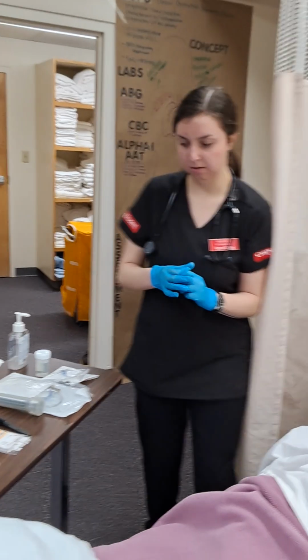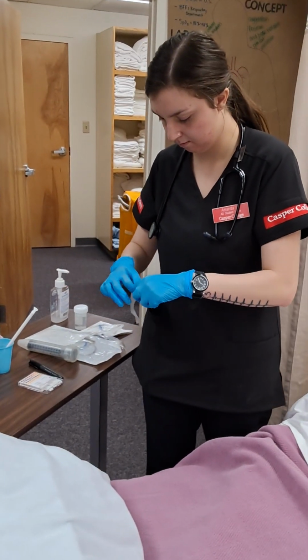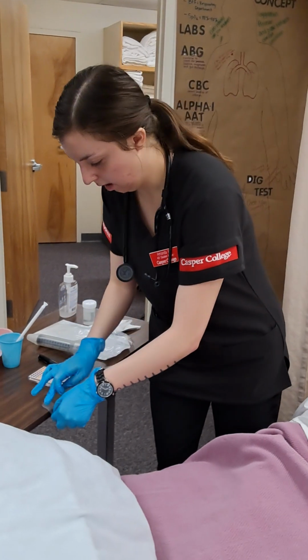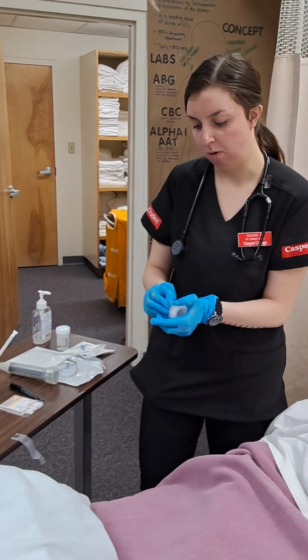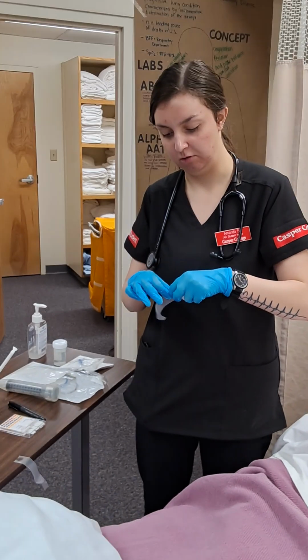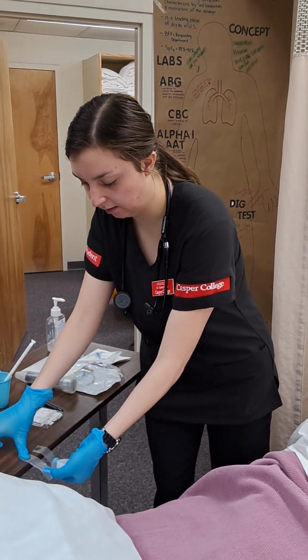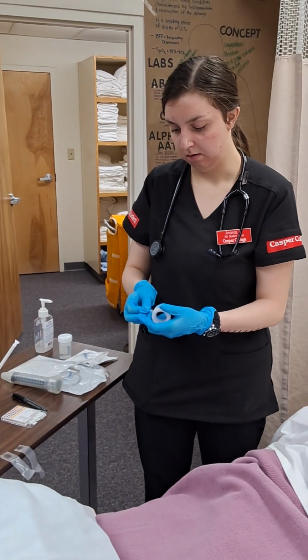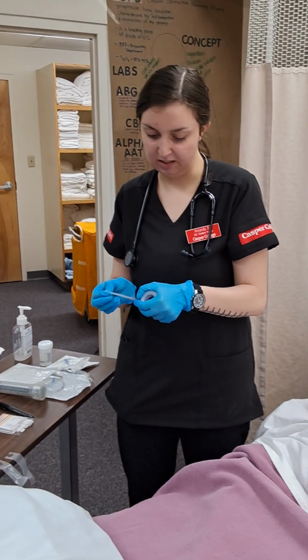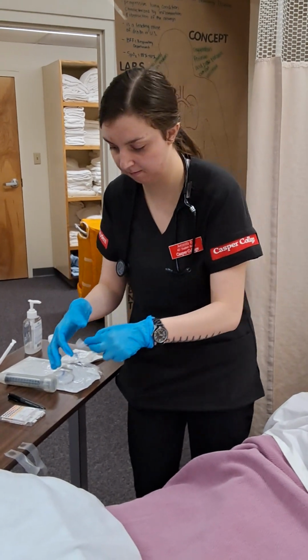Going to get my equipment ready. I would use a skin barrier wipe on his nose before I put the tape on, but we don't have that, so I will just verbalize that. I would use an adhesive fixation device, but we don't have that, so I'll be using tape.